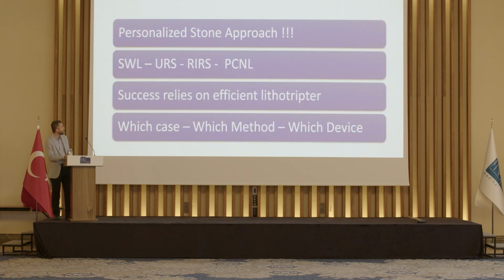In conclusion, what I can say is a personalized stone approach is important. I mean, we need to personalize our treatment options depending on patient-related factors, stone-related factors, and also what we have in the operating theater. If you have a good lithotripter like this, but no shockwave machine, then you can go to PCNL. If you have a good laser, and also the patient has some comorbid conditions like using anticoagulant medication, then you can go with flexible ureteroscopy. But in the end, shockwave lithotripsy definitely has a good role in routine daily practice. We should decide based on a lot of factors and make some calculations for our patients.